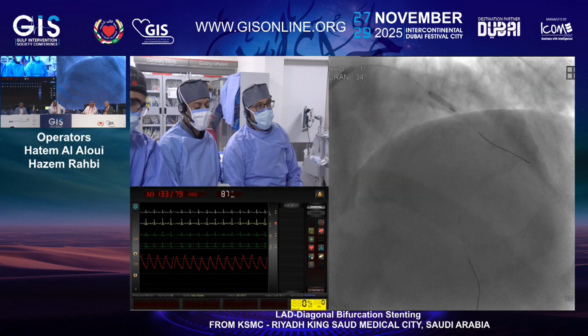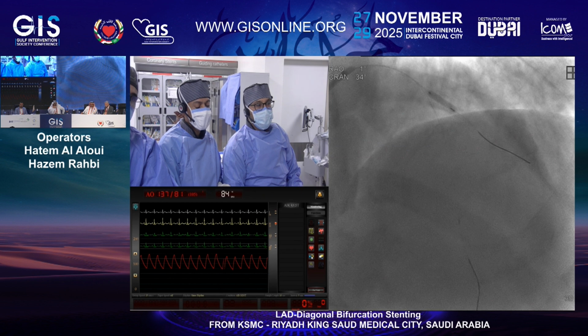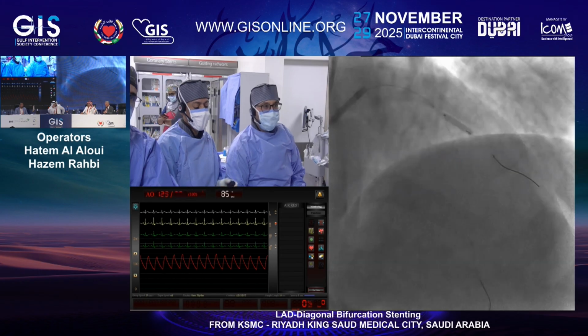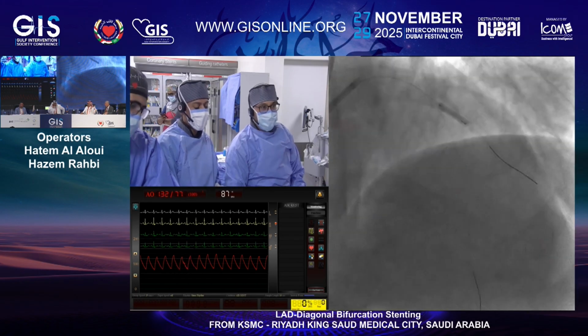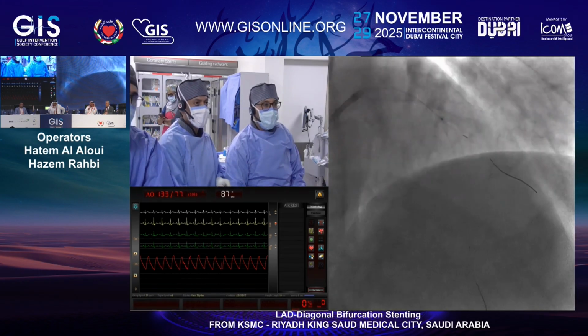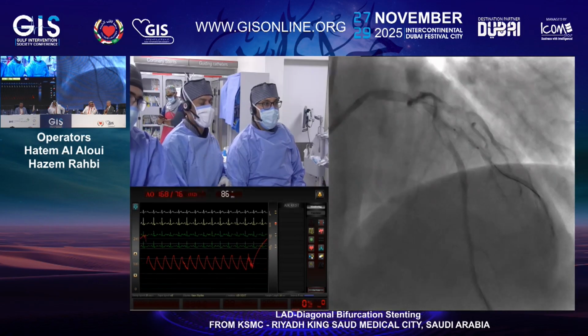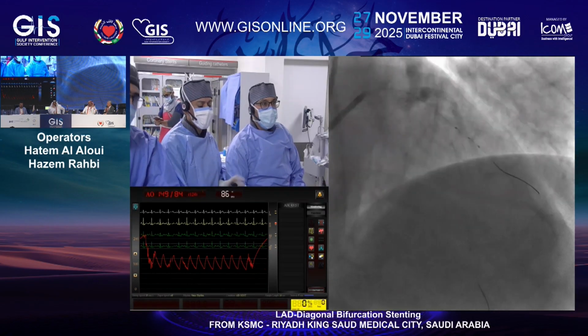Otherwise, it will be a DK crush. Some DCB experts love dissection. They say if they see dissection, it's a well-prepared lesion before DCB. Absolutely, but TIMI flow should not be affected. Small test again, please. Go up again. Yes, I'm going more distal.